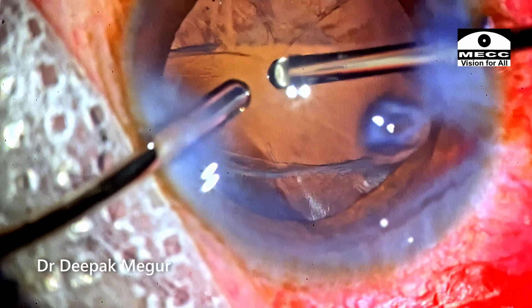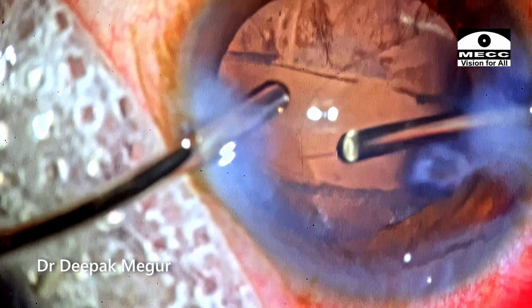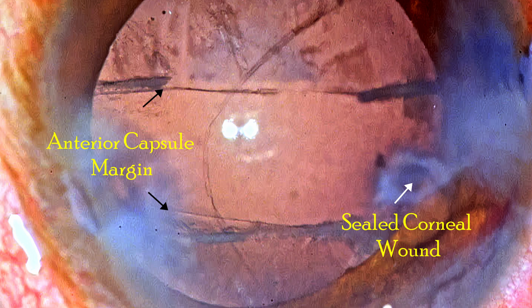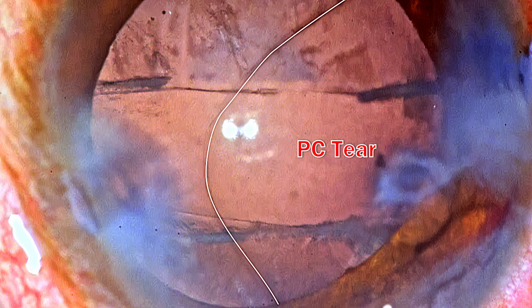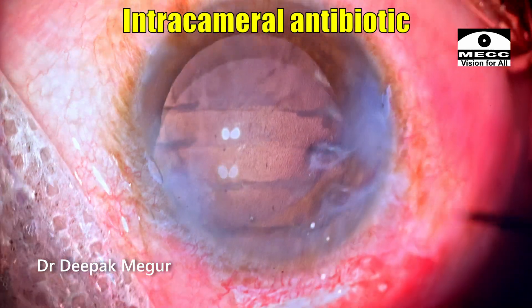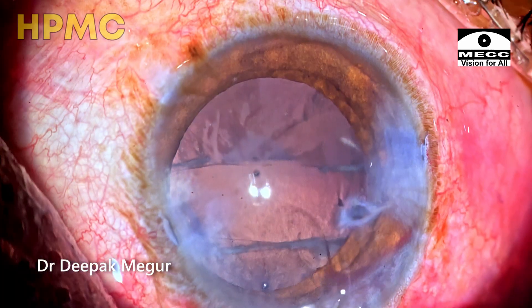Once I'm happy with this, it's time to implant the lens. Let me freeze the picture and show you the different landmarks: this is the sealed corneal wound, these are the two edges representing the torn anterior capsule, this curved line is the posterior capsular tear — this area has no posterior capsule and this area has intact PC. I'm putting intracameral antibiotic into the anterior chamber as well as behind the posterior capsule tear. Time to put in OVD, placing HPMC in front of the anterior capsule to create some space.